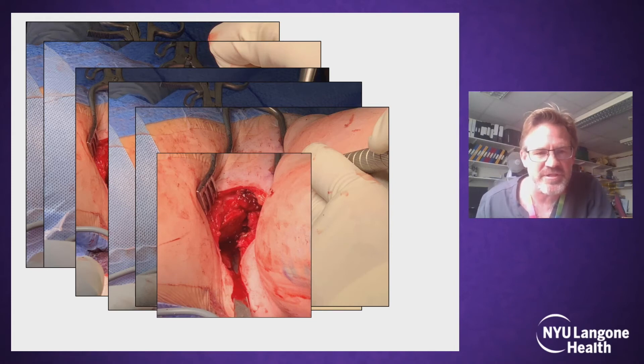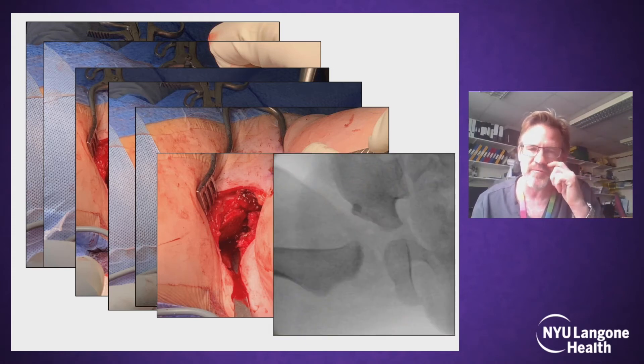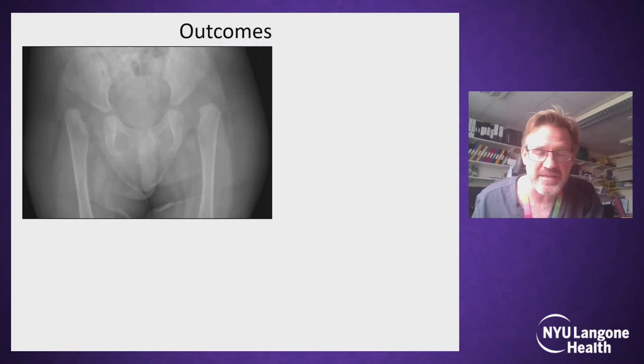Now remove the posterior osteotome. You can see the little calcium sulfate pellet, and it gives this post-operative x-ray view, which you can see is a far from fully corrected acetabulum.